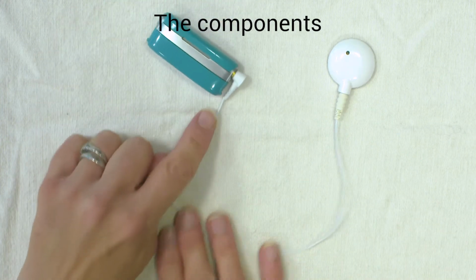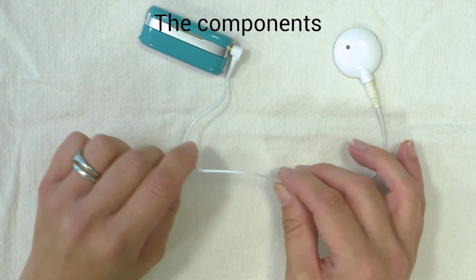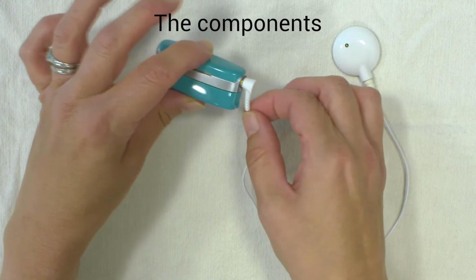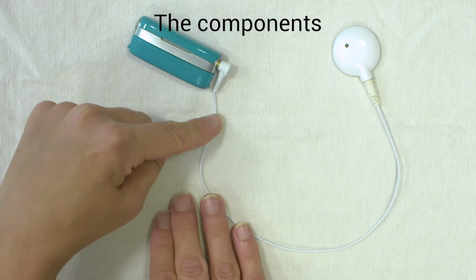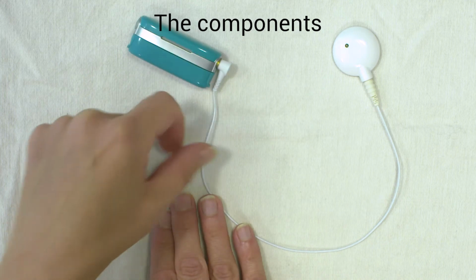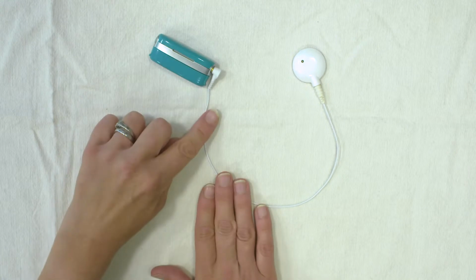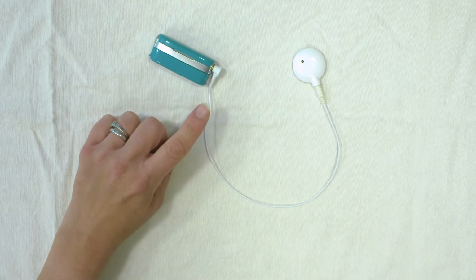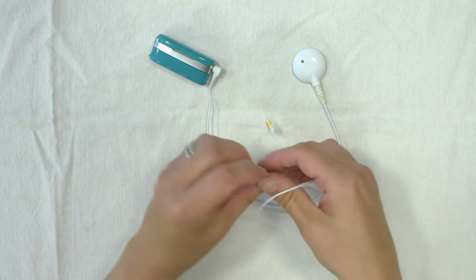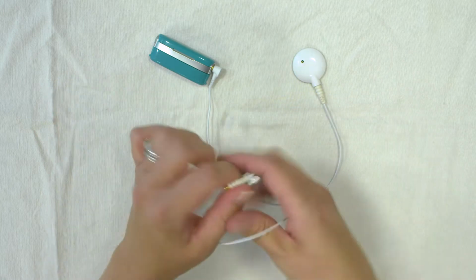This can be the weak part of the processor, the lead, because it's general wear and tear, and it can be pulled at either end while the patient's wearing it. So it's a good idea to keep an eye on these and change them regularly if you notice any breakage. Leads do come in different lengths. So I've got a longer one here, so the patient can wear the processor at different places.